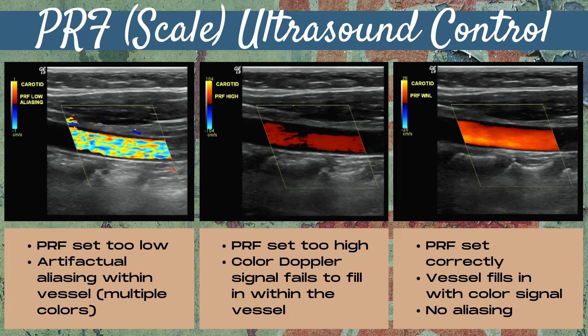Let's look at some color doppler examples of the PRF or scale control. On the image in the far left, you'll see the rainbow of colors within the vessel — this is when the PRF is set too low and artifactual aliasing is occurring because the velocity of the flow is exceeding the Nyquist limit. In the middle image, the PRF or scale control is set too high and color doppler signal fails to fill in within the vessel. On the image to the far right, the PRF is set correctly — the vessel fills in nicely with a color signal and there's no aliasing present.